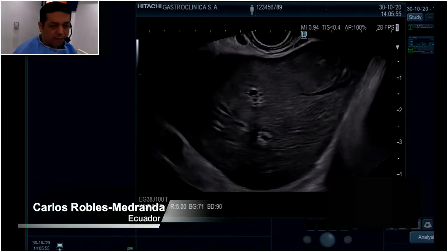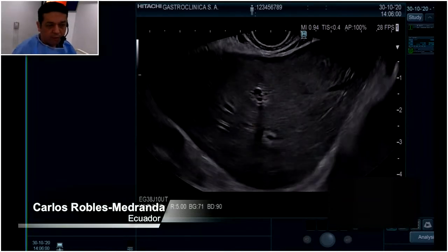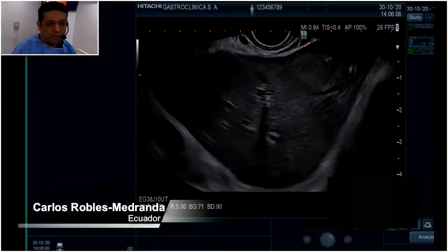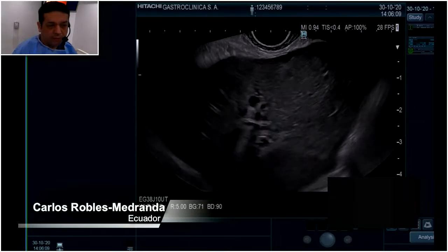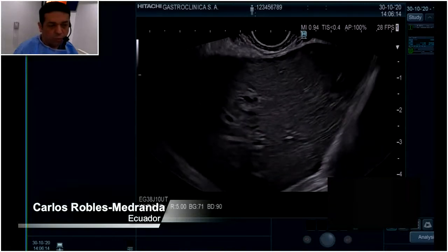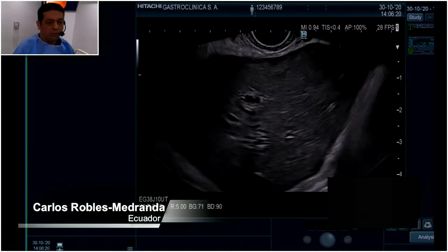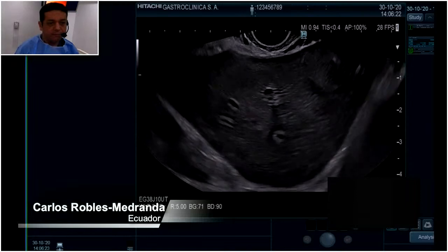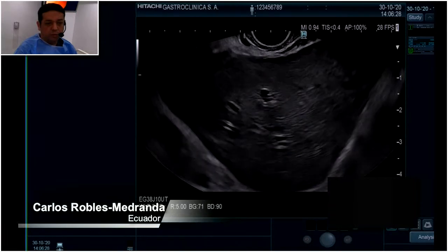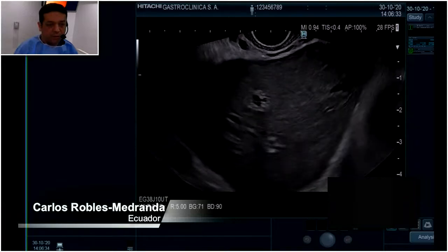So today we want to do a fine needle biopsy of the liver first, because we need to know if this patient needs to receive any other treatment in addition. And second, I will evaluate the Shear-Wave technology. This is a new technology of endoscopic ultrasound, very similar to FibroScan, same technology, to also evaluate the liver of this patient by Shear-Wave and to compare with the biopsy.